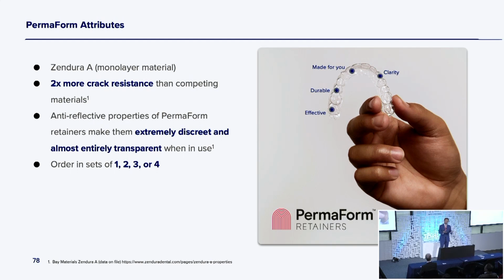So we like to deliver all 4 and tell them, look, these are really durable. You're going to wear them to bed every night. They should last you at least 1 year each. 1 year each, every night, all set. You got 4 years of coverage, but if you did lose one, you open the second one and wear it. We're not supposed to take too many nights off. We want to wear them through. So I like doing the 4-set thing.